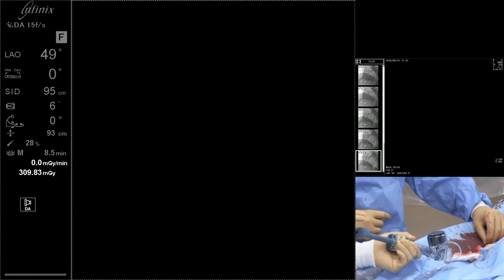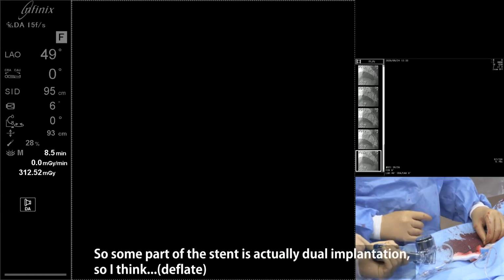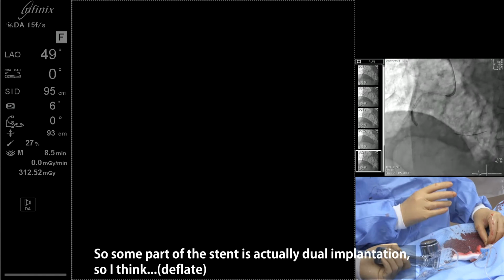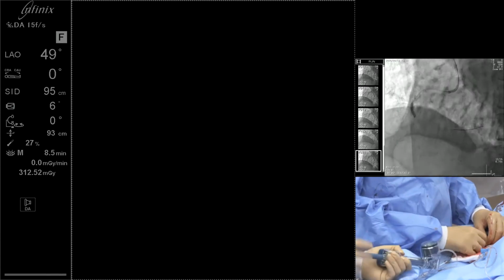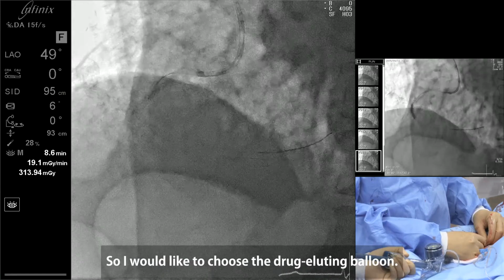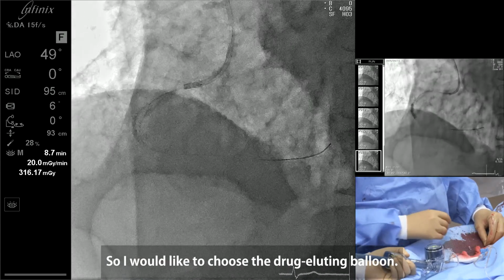So some part of the stent is actually dual implantation. We'd like to avoid the triple stent here. So I would like to choose the drug-eluting balloon.